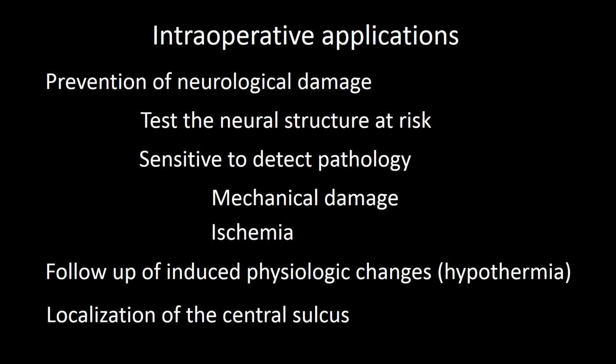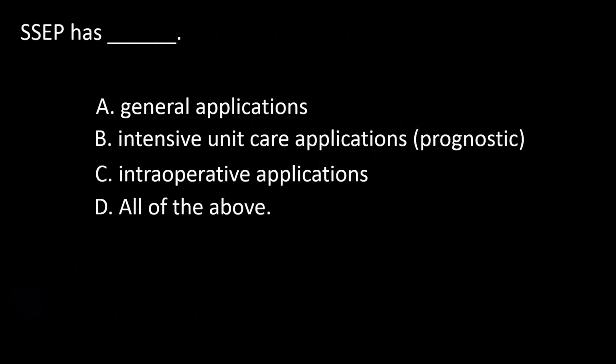And it also has intraoperative applications, such as prevention of neurological damage by testing the neurological structures at risk for mechanical and ischemic damage, for monitoring of induced physiological changes such as hypothermia, and for localization of the central sulcus. So the answer to this question is D.